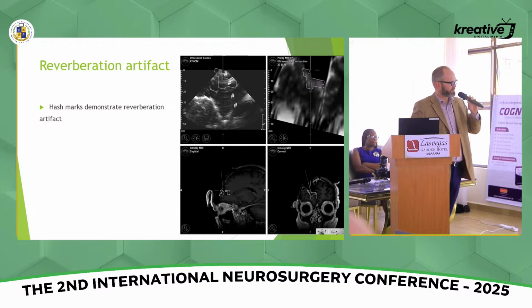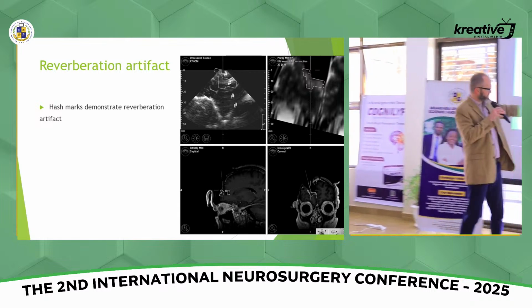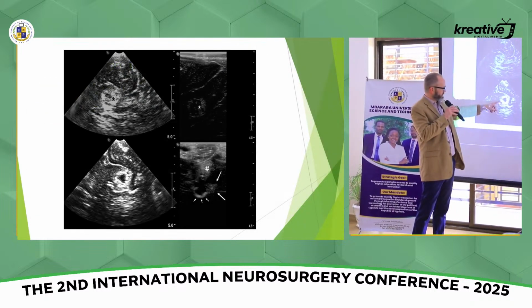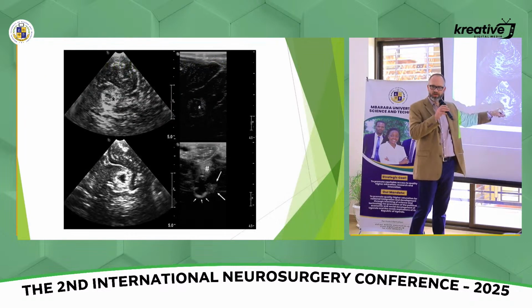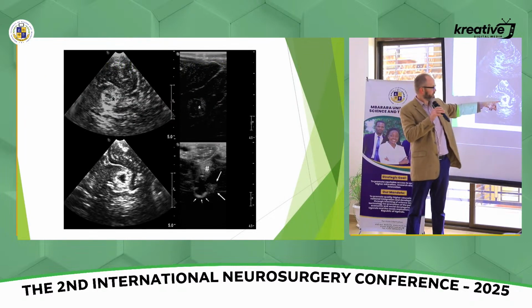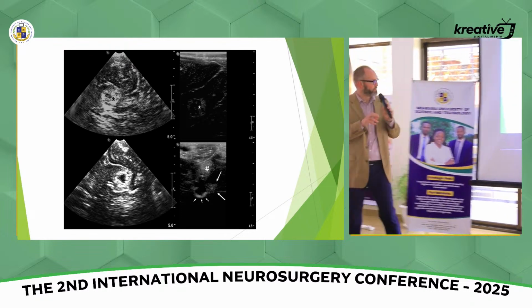This is an abscess, just to show you an example. You see the wall of the abscess and the center of purulence or necrosis. So that shows up quite well.